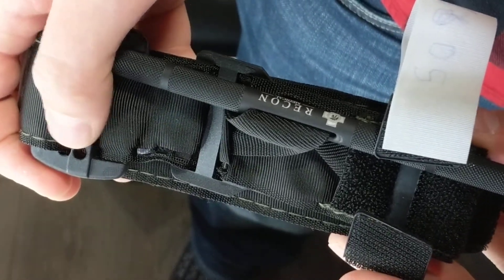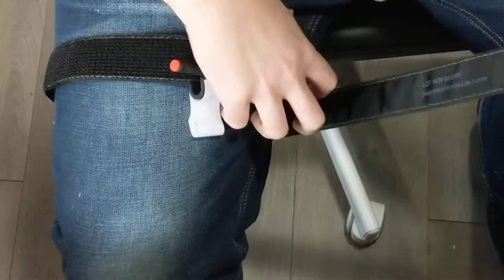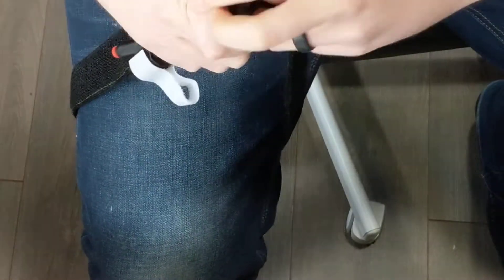This video is going to show the application of the Recon Medical Gen 4 tourniquet. We're just going to open it up for application on the leg. You can get in and around and feed through the buckle.